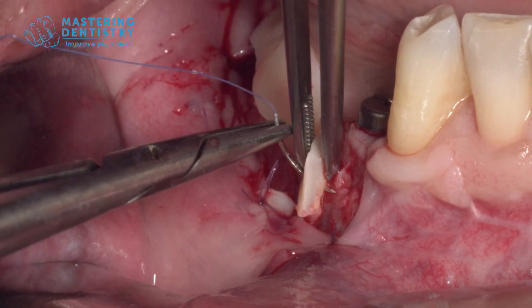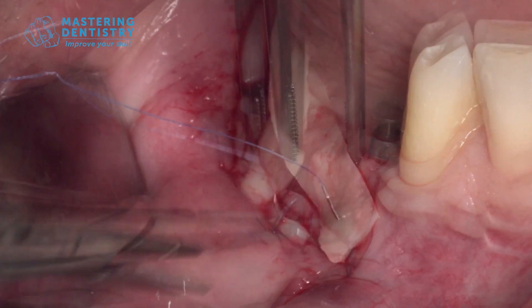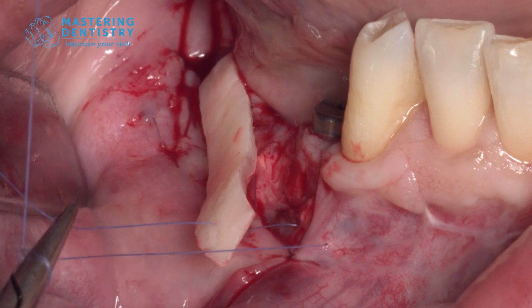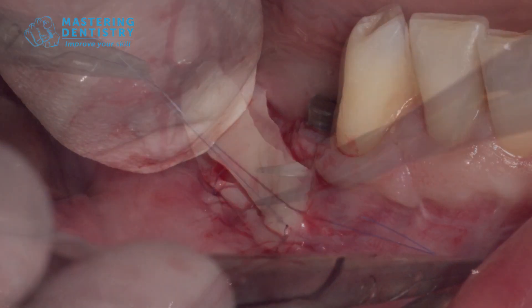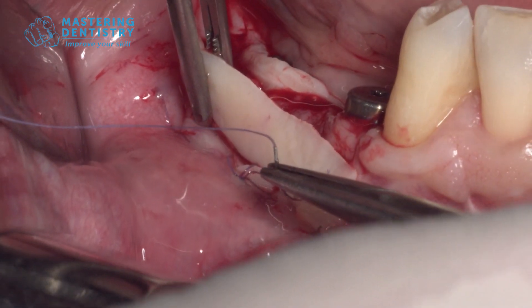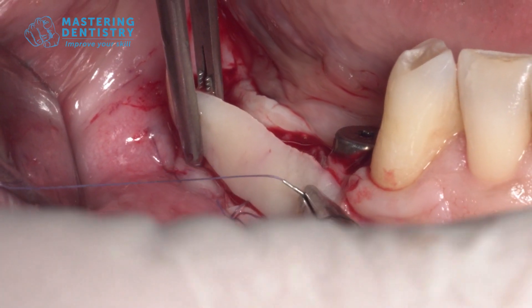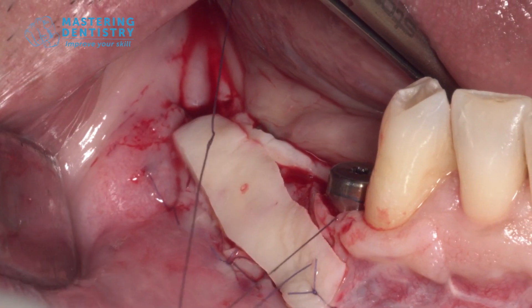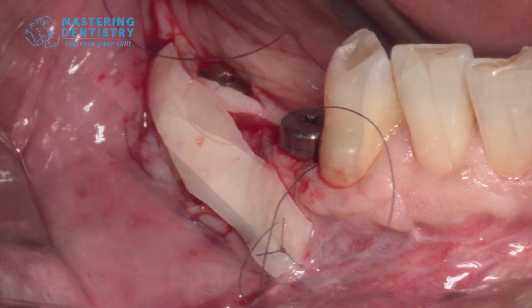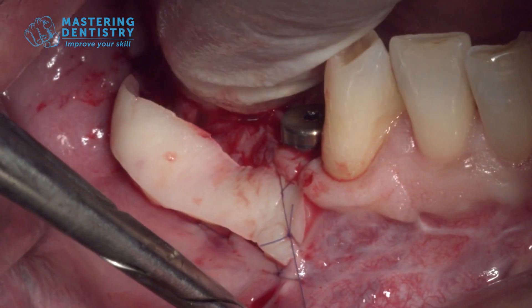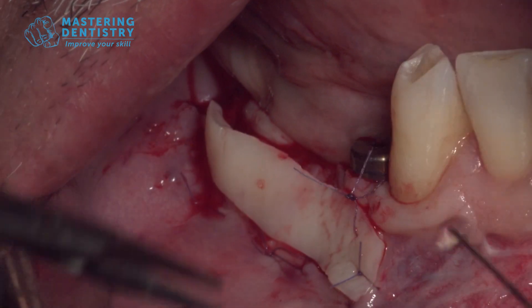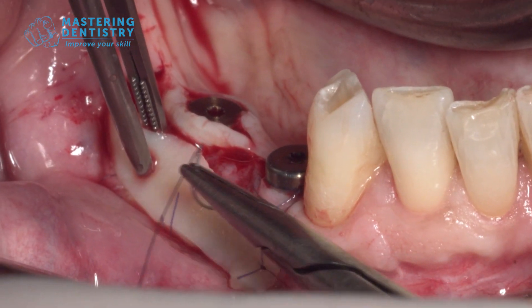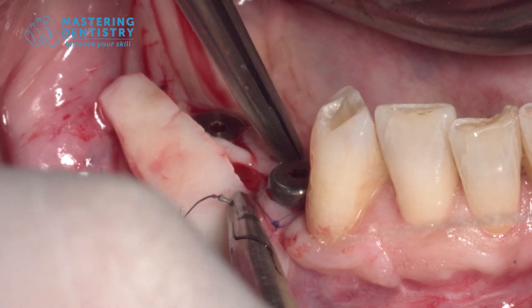The last step is to position and stabilize the graft over the recipient side. We start with some sutures all around the boundaries of the graft. The most important thing is to fix the sutures to the underlying periosteum — to anchor them to the periosteum — to stabilize the graft and link it to the periosteum, because it is from the periosteum that the vessels will come and vascularize the graft. If they have to move, they have to move together, so we have to have a single unit between the periosteum and the graft.